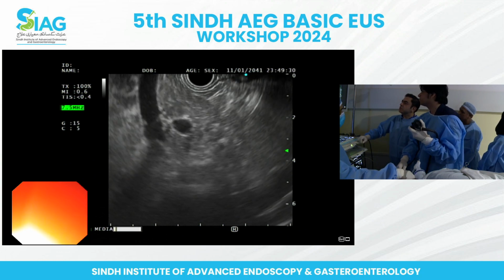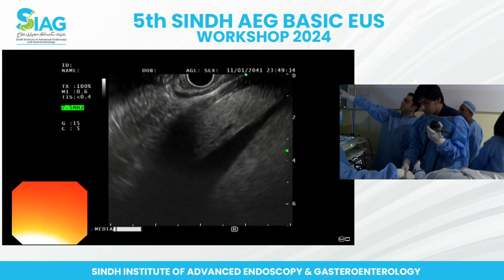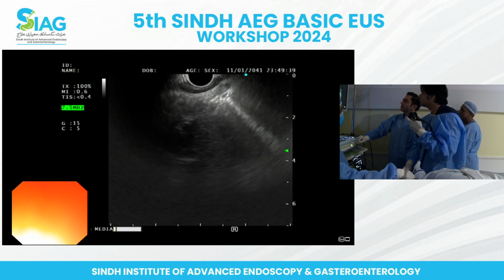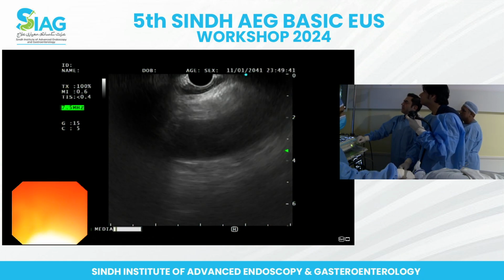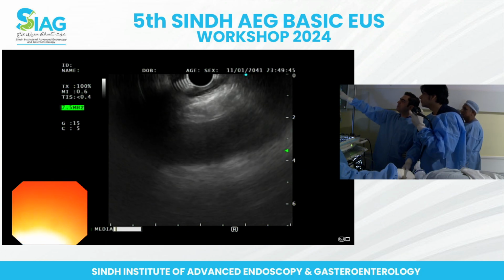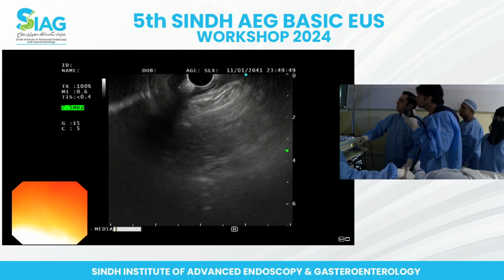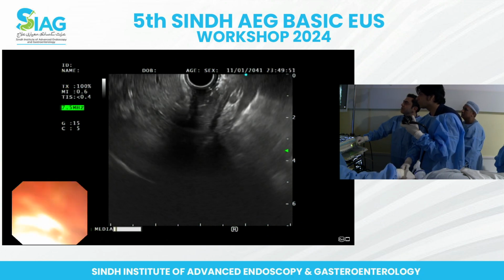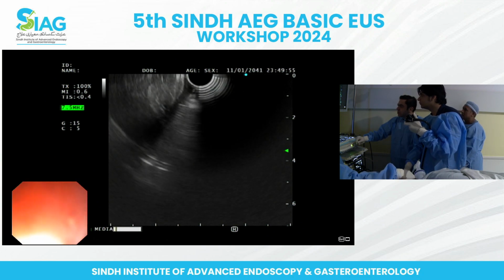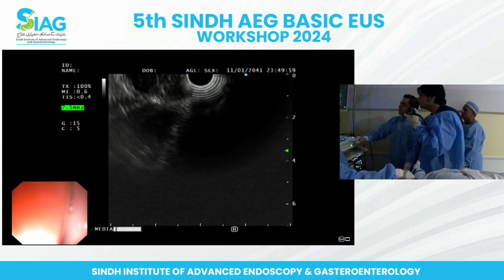Now go at the GOJ. So what you would see is that next to the transducer, you will see thickening of the mucosa, okay? So you can see it first endoscopically if you wish, but it seems to be coming up now. So see if you can find it endoscopically, and then you can pull back so that you know exactly where the GOJ is and where your lesion is. Yeah, excellent. So you're a bit up on that. You can go into the stomach.